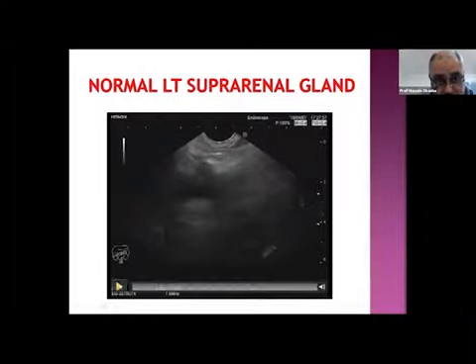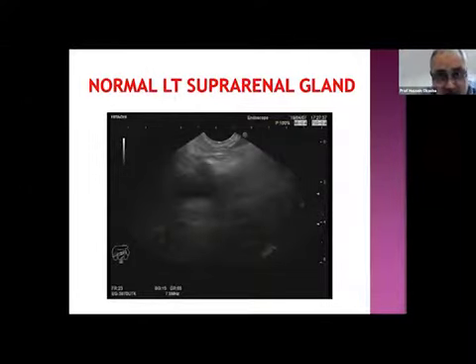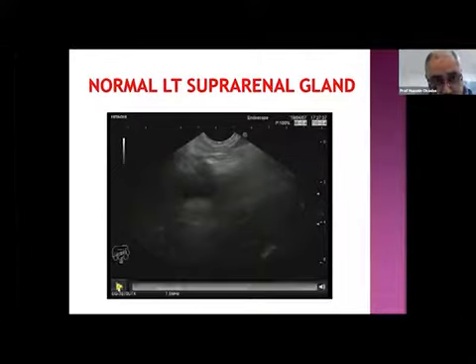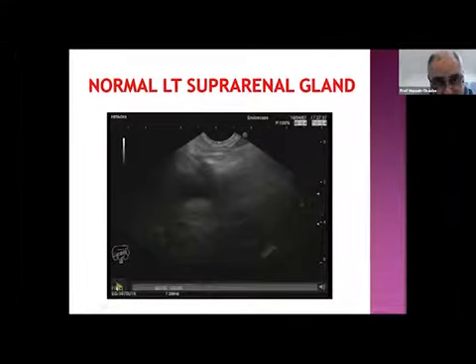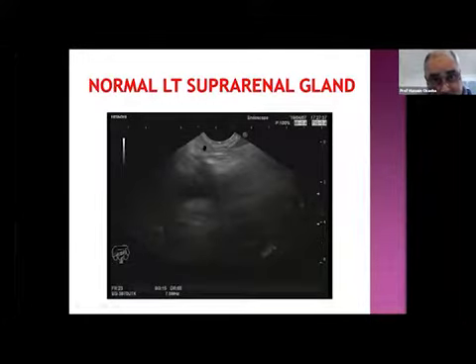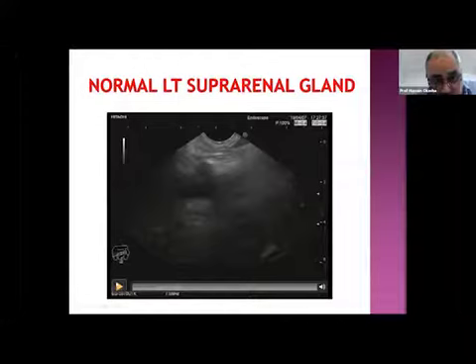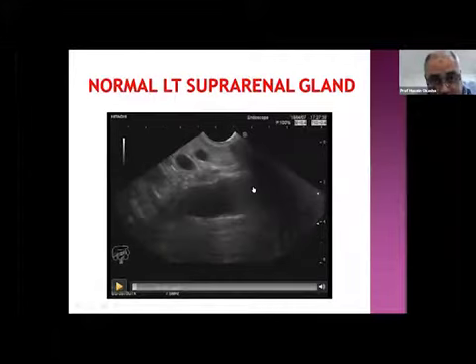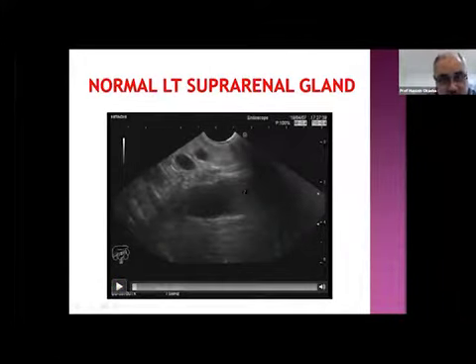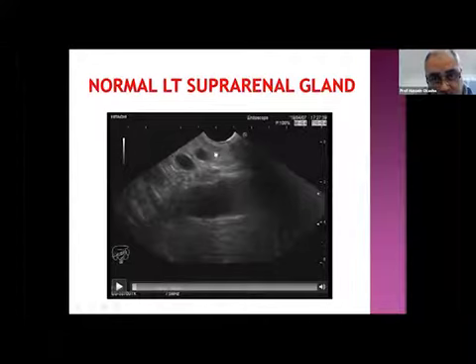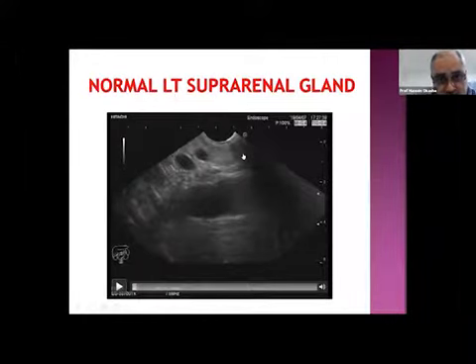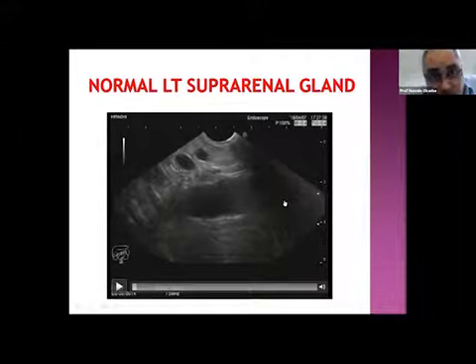Let us see what is the normal appearance of the left suprarenal gland. Having worked in sonography for 30 years, I can rarely see the suprarenal during sonography. I used to believe it was a rounded structure, but the normal suprarenal gland is not rounded at all — it has a seagull appearance: a very small body and two long wings.